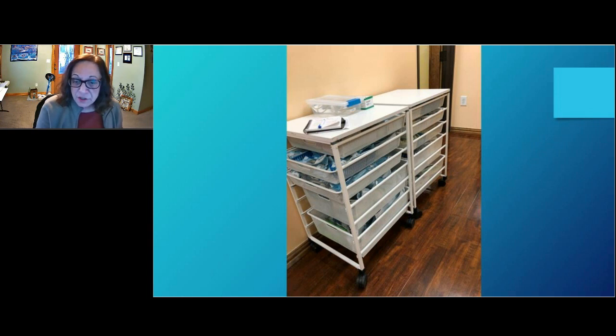I don't know if you can see this in the picture, but these are not solid drawers. They're like mesh. Plus, they're not completely enclosed. There's a gap in between every drawer. So there is plenty of space for spatter and spray to enter those drawers and potentially contaminate those instruments. Again, that's a situation where I wouldn't want those instruments used on me.